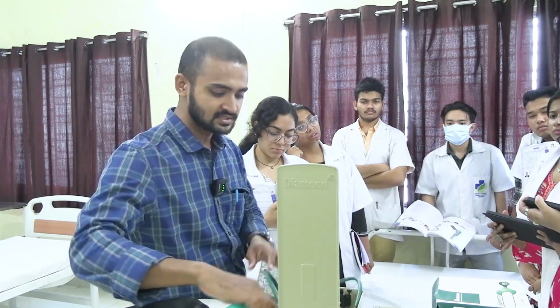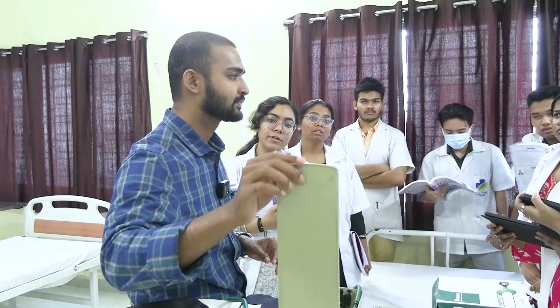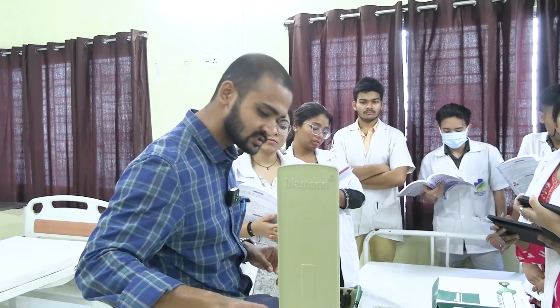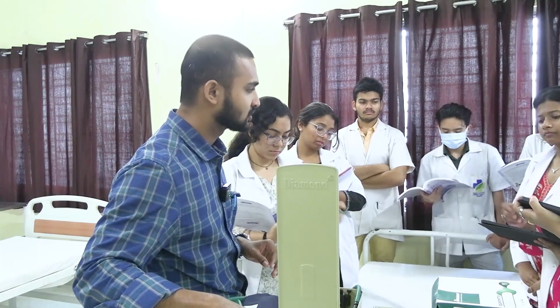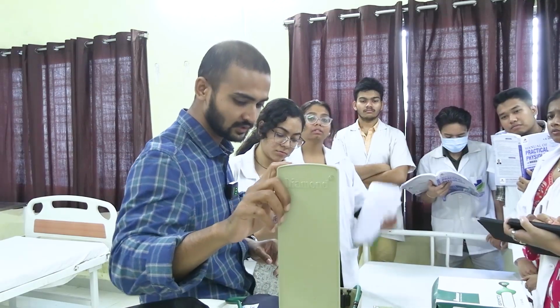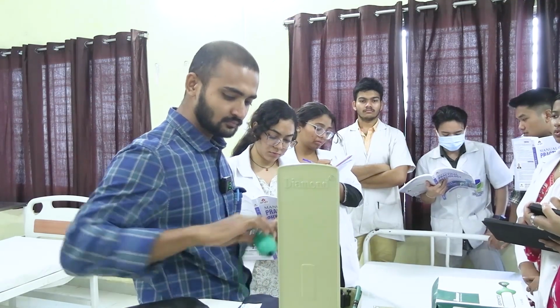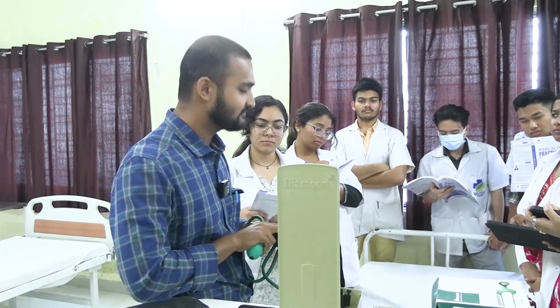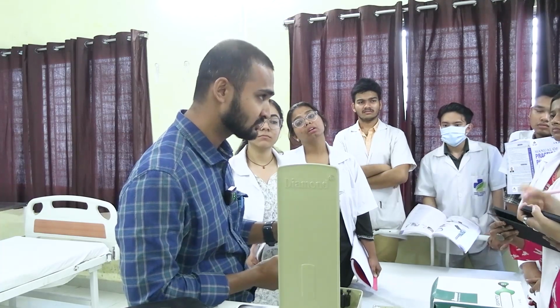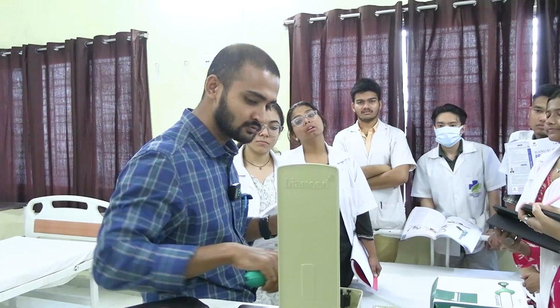And what is this? This is a manometer. There are graduations, you can see. The distance between each small graduation is 2 mmHg, 2 mm of mercury. The lowest point is 0 and the highest is 300. When you place the cuff on the arm of a patient and press to give the pressure, the bag will be inflated, and the pressure will correspond with the mercury.